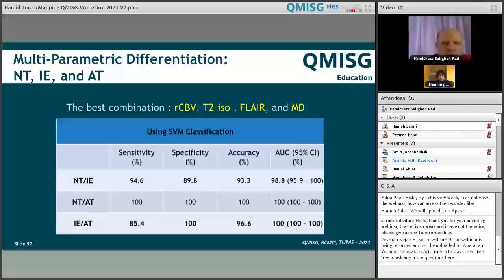But in the next attempt, we had most of the imaging modalities we could line up at our clinic, and we also got the multi-point biopsy co-registered at the point of pre and post surgery, and we extracted many features out of this quantitative modality.